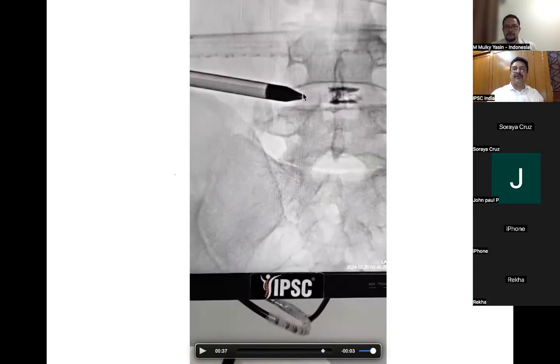Foramen now. Look at this. Now with this, I'm not going inside the disc. I'll keep it here only. We don't want to go inside the disc with this. If I pass the guide wire inside the disc, that is the inside out technique. But here we are doing for the extruded disc, right? We saw the extruded. Outside in technique. That's why we are keeping the dilator outside the disc.